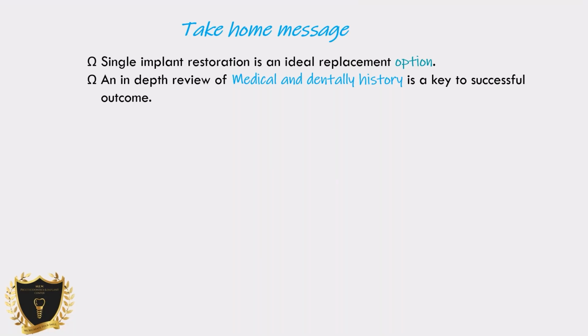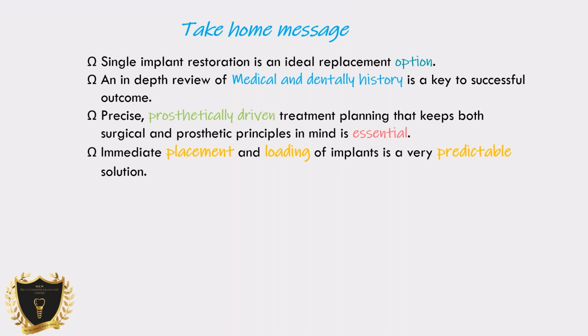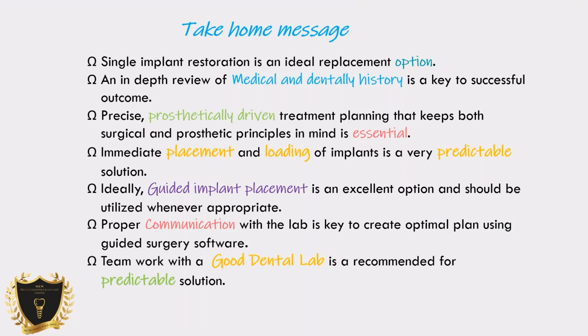An in-depth review of medical and dental history is key to a successful outcome. Precise prosthetically driven treatment planning that keeps both surgical and prosthetic principles in mind is essential in treatment. Immediate placement and loading of an implant is very predictable. In a lot of cases you can take the tooth out and place an implant. Having said that, mind that you have no infection present and you have a socket present to place an implant. Ideally, guided implant placement is an excellent option and should be utilized whenever it's appropriate or possible, because it will give you the best result.